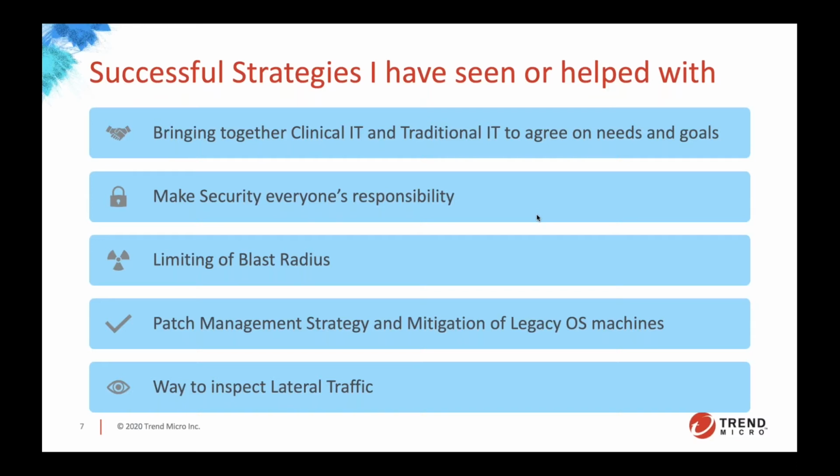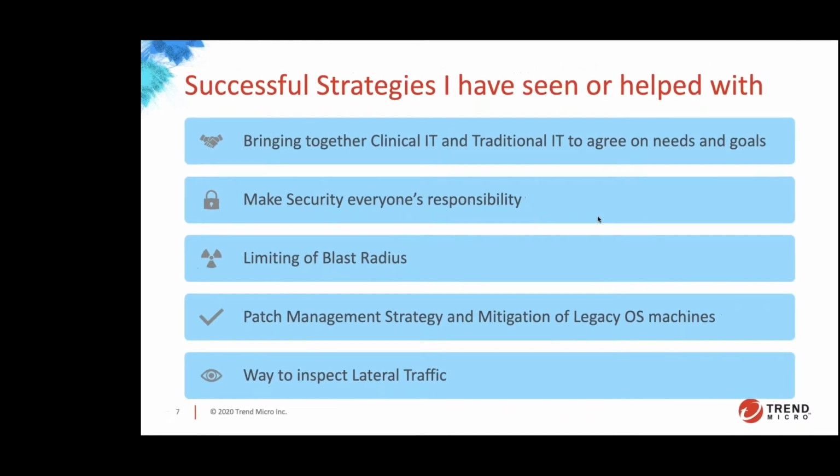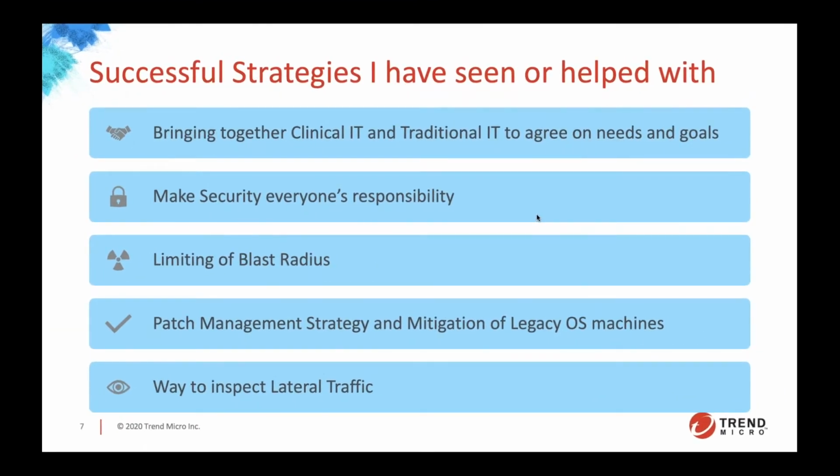The other one that's huge, and this is before we ever get into the technical piece, is really making security everyone's responsibility. This is a basic thing, but when you walk into a room and there's an SD card or a USB key sticking out of a device, whether it's a tech or a nurse or anybody in that environment, they should say that's not normal, and that needs to be alerted and brought up. Those ports in most cases should be disabled if they're in a public space or a patient accessible space, but they're not always, right? So making sure that's alerted to somebody who can investigate it.